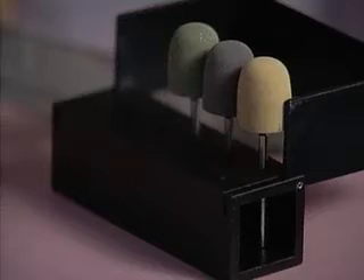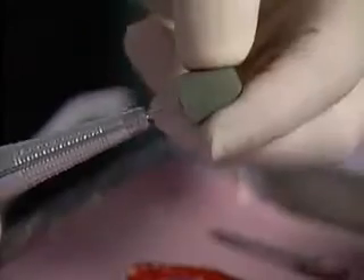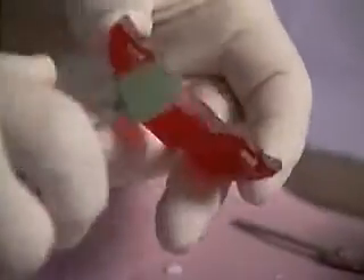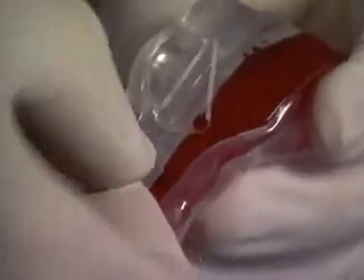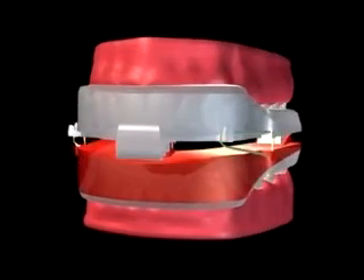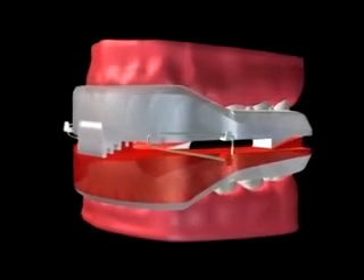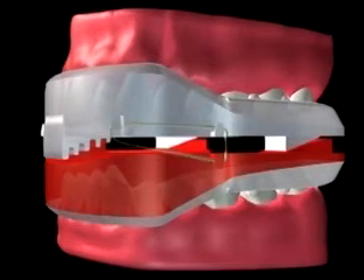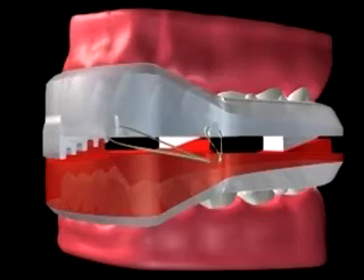Next, use the three universal polishers from the kit, starting with the coarse green polisher, followed by the medium black, and finally the fine yellow polisher. The final step in the NORAD fabrication process is connecting the upper and lower components with elastics over the cleats in order to prevent the jaw from retreating during sleep. The lower jaw should be placed in a comfortable, unstrained position using the notches located in the most anterior portion of both devices. Generally, this is the ideal position of elastics, but placement is ultimately based on the need for anterior repositioning.